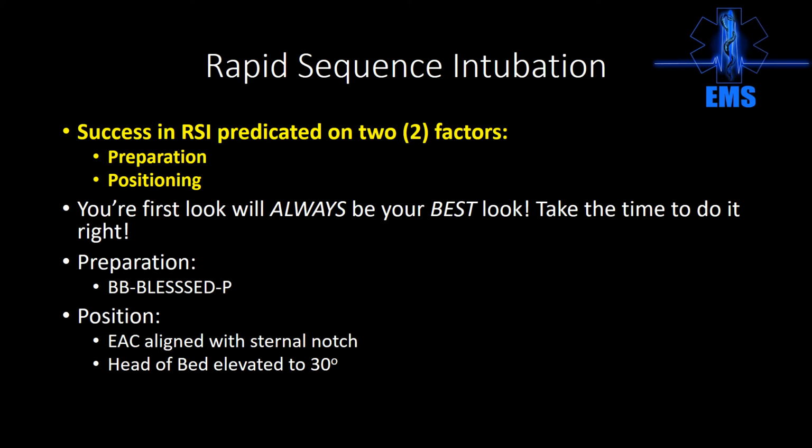Also, we need to elevate the head of the bed to 30 degrees. This does two things, actually three things. Number one, it decreases intracranial pressure, and a good number of our patients that we are intubating, we're worried about their intracranial pressure. It decreases the risk of aspiration.